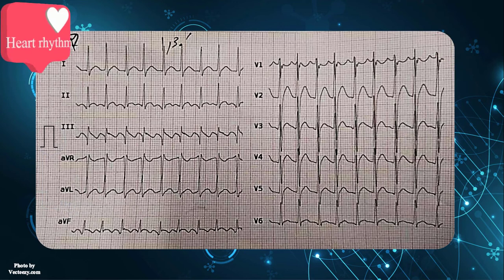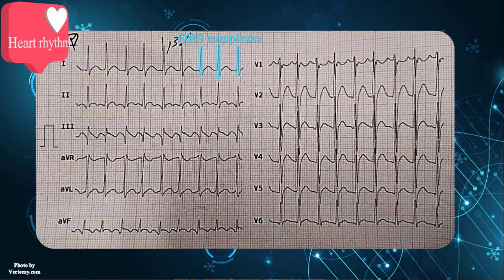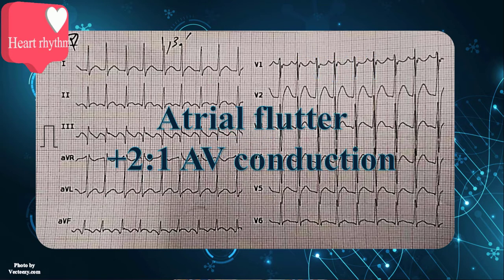Next is cardiac rhythm. There are inverted P waves at a rate of 335 beats per minute in inferior leads, forming a sawtooth pattern. The atrial activity is visible in V1 as well. In addition, the QRS complexes are narrow, regular, and uniform. The ratio of P waves to QRS complexes is 2 to 1.